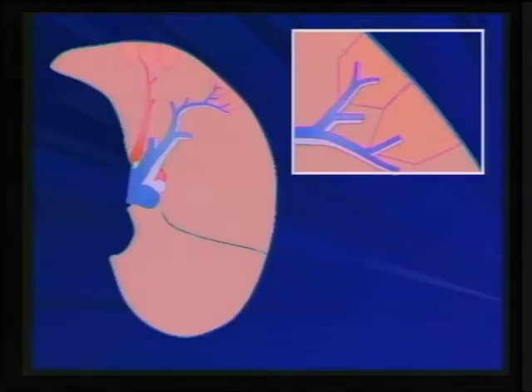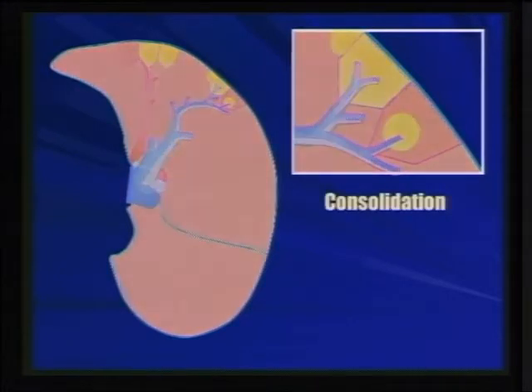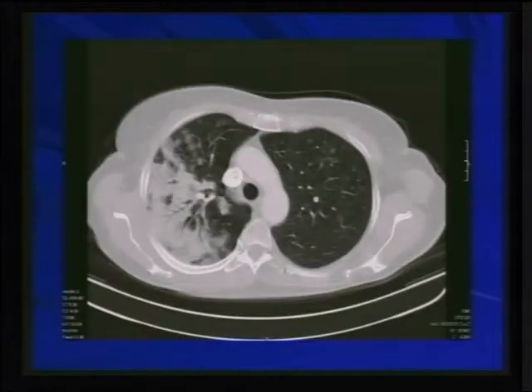This is much easier to recognize because it is within the confines of the secondary pulmonary lobule. You will start at the level of the air sac, then spread into the level of the acini, and then the secondary pulmonary lobule. From there you have progression of disease into segmental and lobar disease and diffuse consolidation. So again, within the confines of the secondary pulmonary lobule.